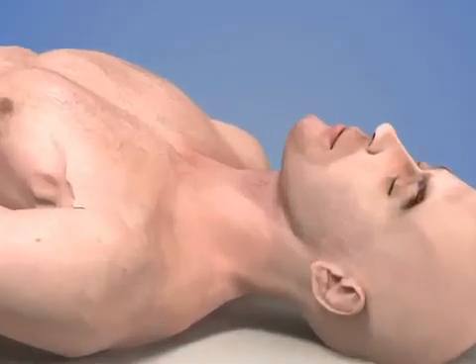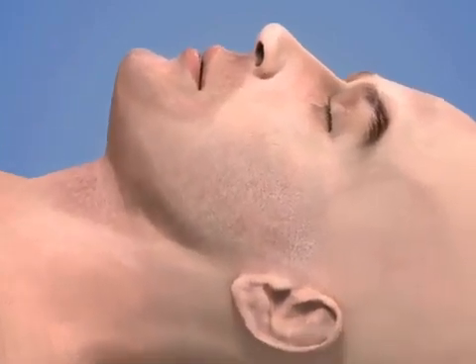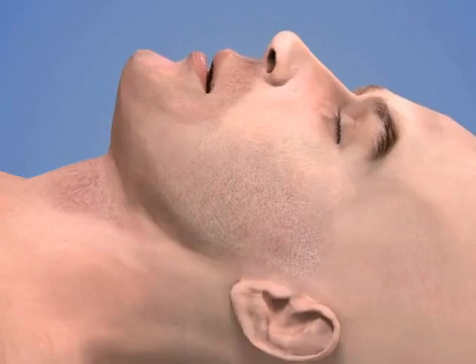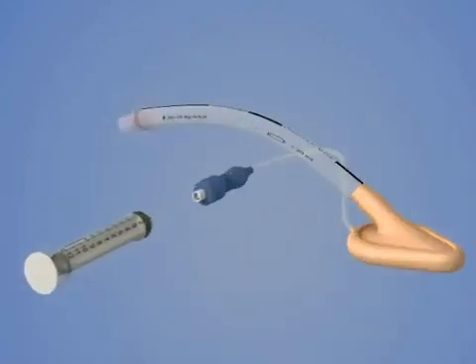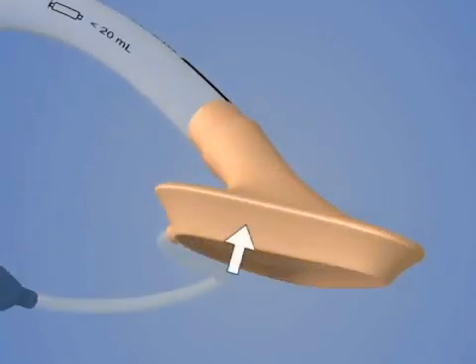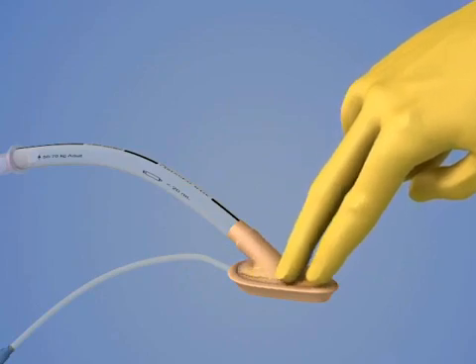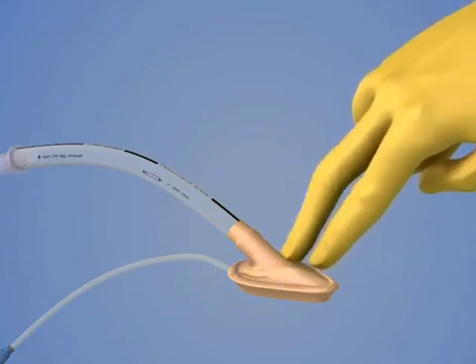Position the patient supine in the sniffing position with the neck flexed and the head extended. Completely deflate the LMA cuff until it forms a smooth wedge shape without any wrinkles. Place a small amount of water-soluble lubricant on the LMA mask prior to insertion.